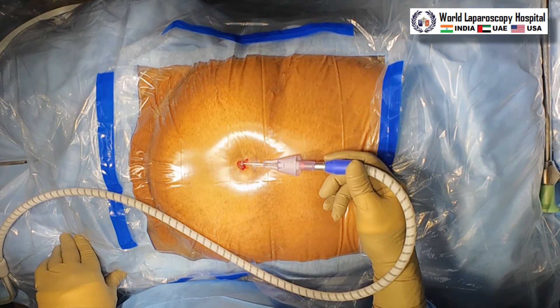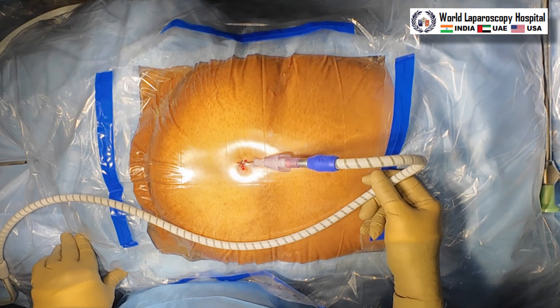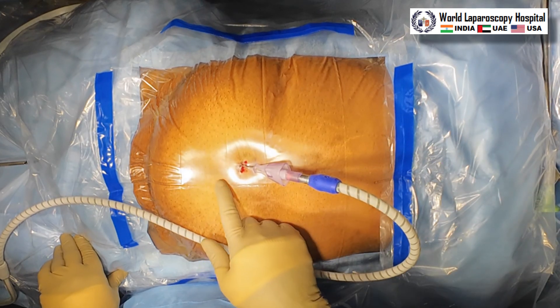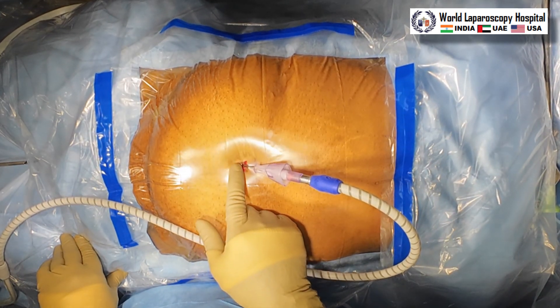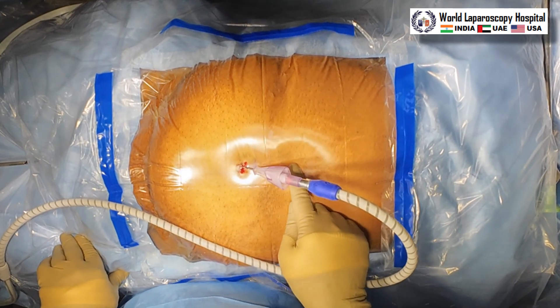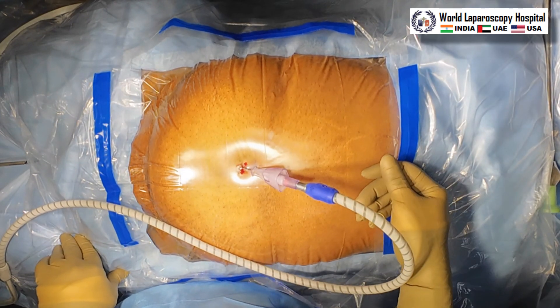The minimum amount of gas required to achieve a pneumoperitoneum of 15 mmHg in a normal adult is 1.5 liters, and the maximum is 6 liters. The variables you know include: size of the patient, parity, muscle relaxant, bowel preparation, and any space-occupying lesion. We will put the trocar here supraumbilical.